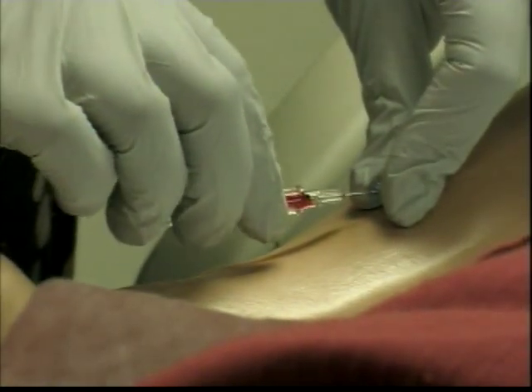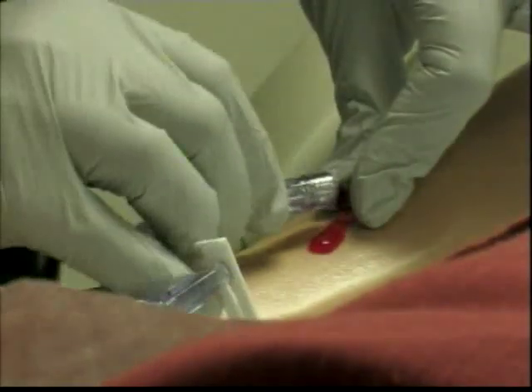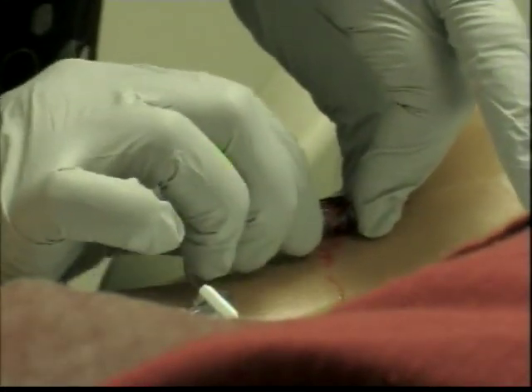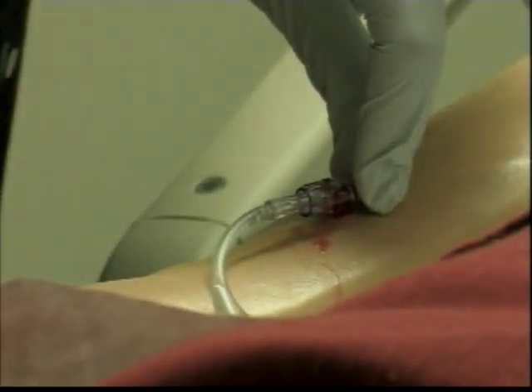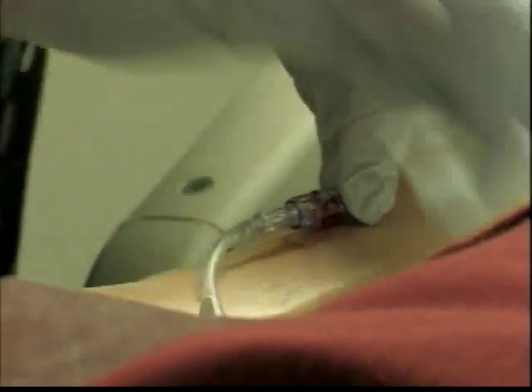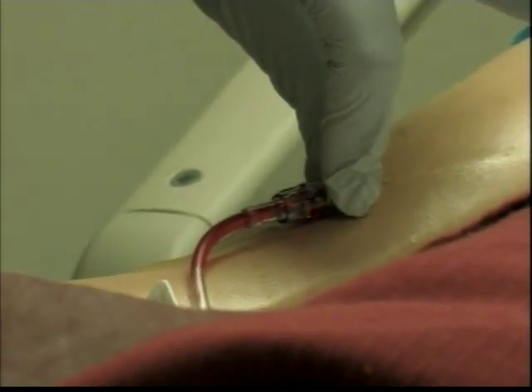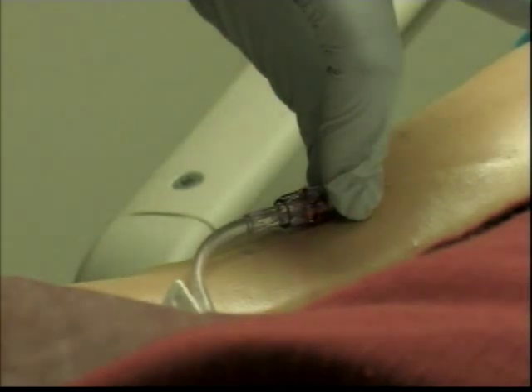So you want to make sure that you remove this, cover it, and then you're going to connect it, and you're going to twist it. Look at my fingers where they're at. I'm holding the hub, and I am performing a twisting motion to lock this in place. Okay? You have extra gauzes that you can use to remove any extra blood. Then you're going to aspirate, make sure that it's still in place and you see the blood. You're going to flush the system with the amount of saline that you have in there.